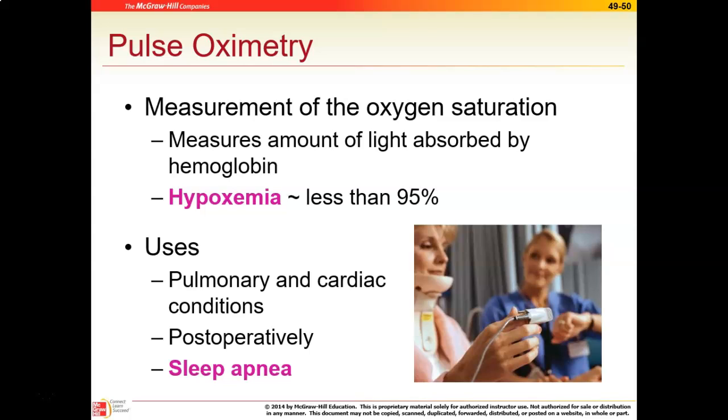Anytime you're in the hospital, they'll usually do this. Definitely if someone has any pulmonary or cardiac conditions, pre- and post-surgery, as well as during surgery, it's on. And a lot of times people that have sleep apnea will also have episodes where their pulse ox will drop really, really low during certain sleep hours, so it's also used in that respect as well.